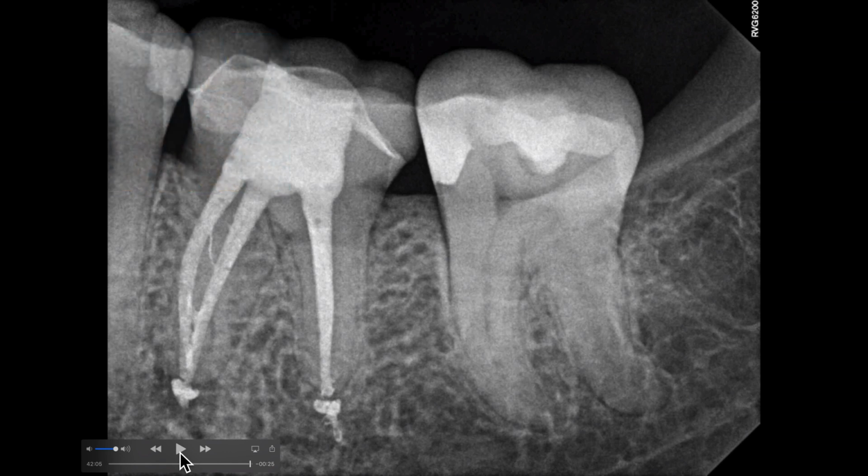But look at that outcome. So kind of start talking through the magic of the show, and that is, look what the GentleWave did to that mesial root. That was my causative root, right? That's where I knew the bacteria resided inside. And you can see on that, that there really wasn't an isthmus up here. And I saw that the whole way through. It made me nervous. I talked about it. It really kind of, man, I want to see more than that. But you look at these finer details, and the only way this could happen is through fluid.